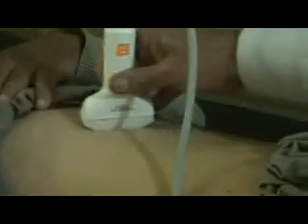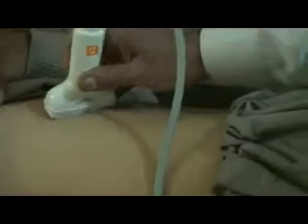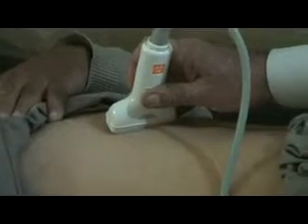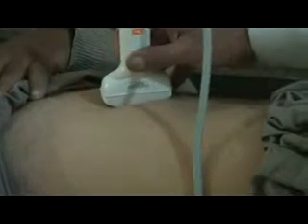And now there is another view to be used in case the patient is in left lateral decubitus posture. These are the intercostal spaces. This is the subcostal region. In the 6th or 7th intercostal space, better in the 6th one, place the probe here and then angle it towards the left axilla of the patient, and you will get a view of the gallbladder.